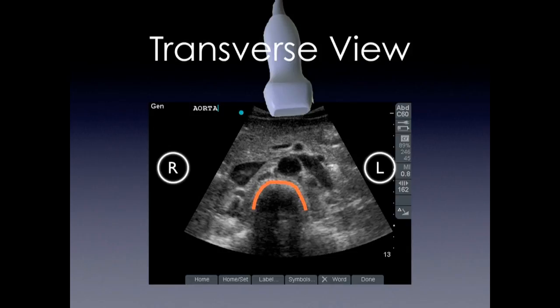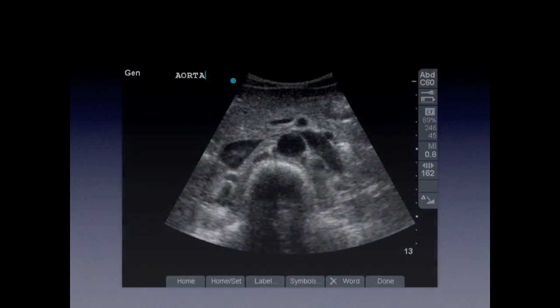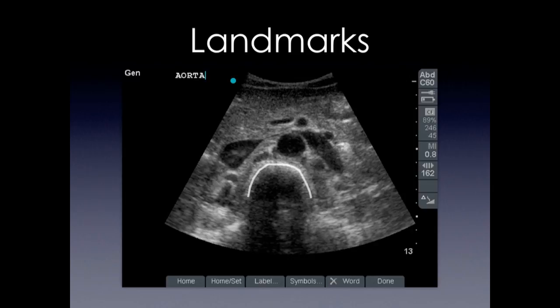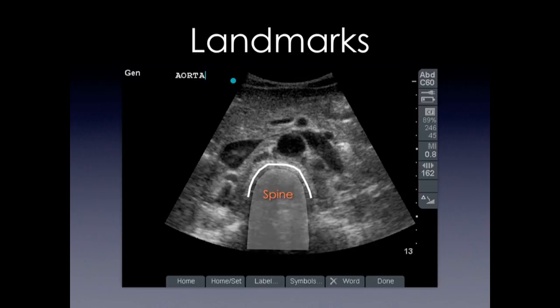Our main landmark is going to be the spine. It creates a shadow, and we're going to make sure we have the spine so we can confirm we're looking at the aorta. There are other structures nearby, such as the inferior vena cava.